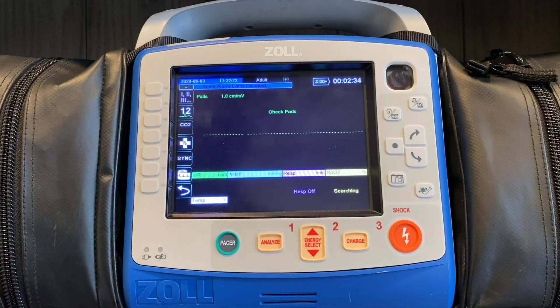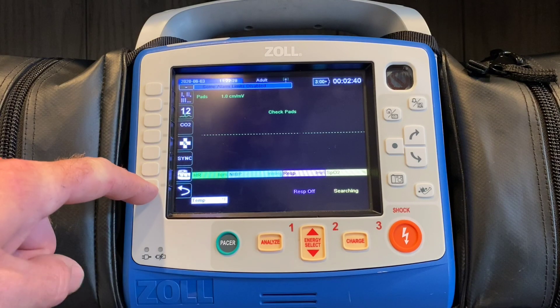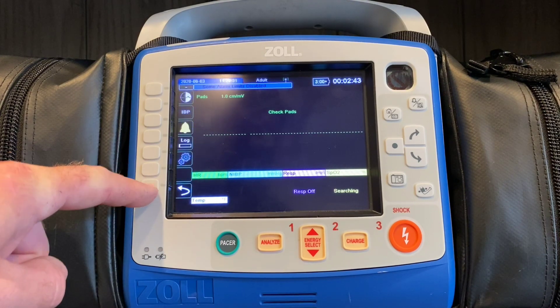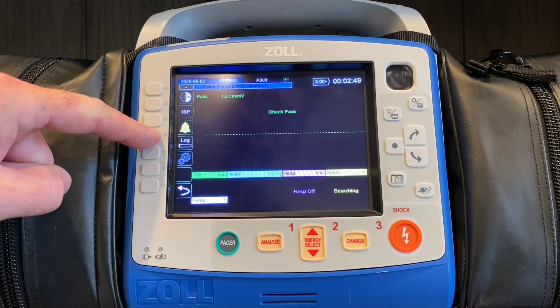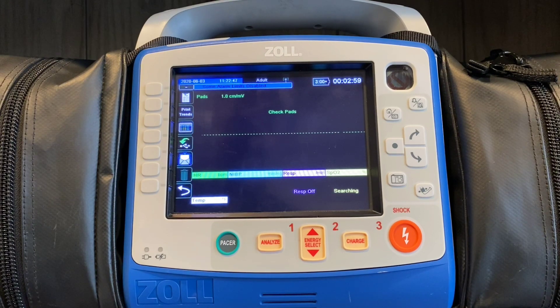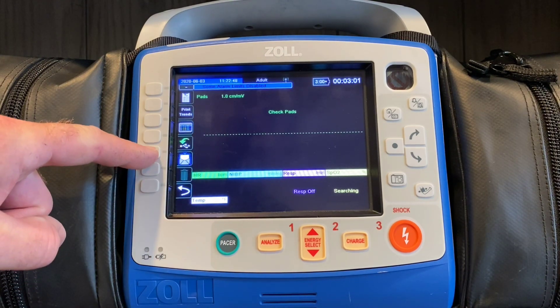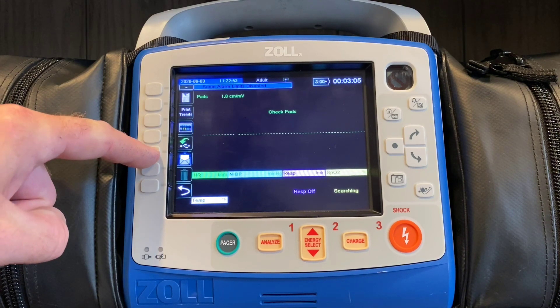The first thing we're going to take a look at is the process in which we move the data from the X-Series. Bottom left corner, the white arrow that loops back — go ahead and press that; that'll bring you into the second page of options. The fourth button down says log. This is essentially the memory of the machine, so whether you're going in here to print out a code summary or trending reports of the vitals during the call. You also have the ability to go into this white envelope.